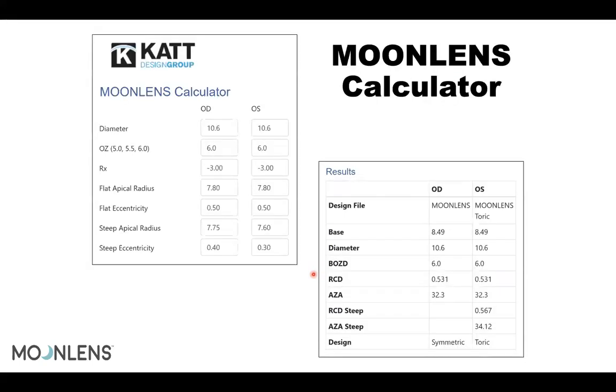So like I was telling you, here's another example, and this is just with the standard eccentricity, and it's going to create the lens based off that, and it's going to tell you the type of lens you are ordering, and that's very helpful, and that's going to be more precise for you, because you can just enter your own data and that can create your lens, right?